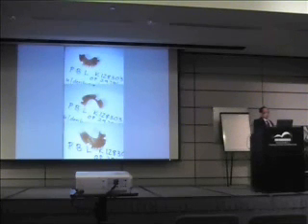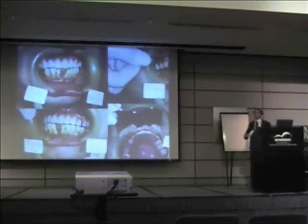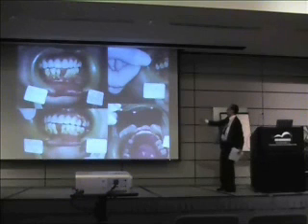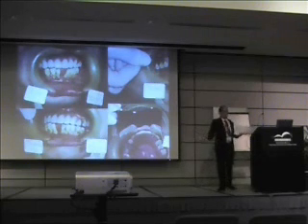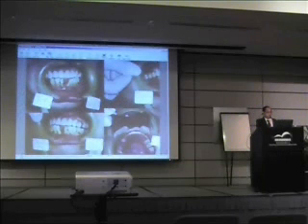You fit the denture into the patient's mouth. And it looks nice. That's what she wants. She got exactly what she wants. And it looks nice. Acceptable. How do we secure this denture to the jaw? She doesn't want any clasping. She wants something that will be fitting. Okay? That's the way the denture looks like.